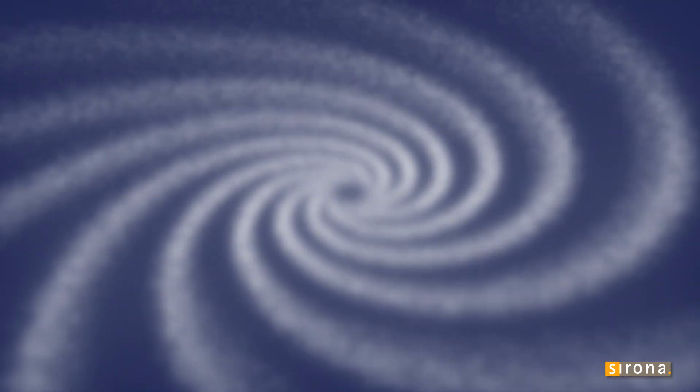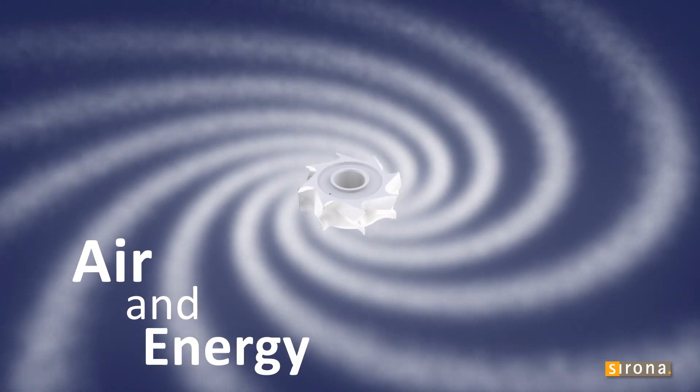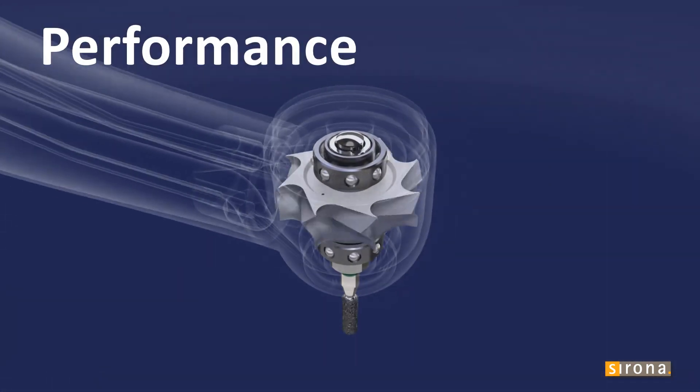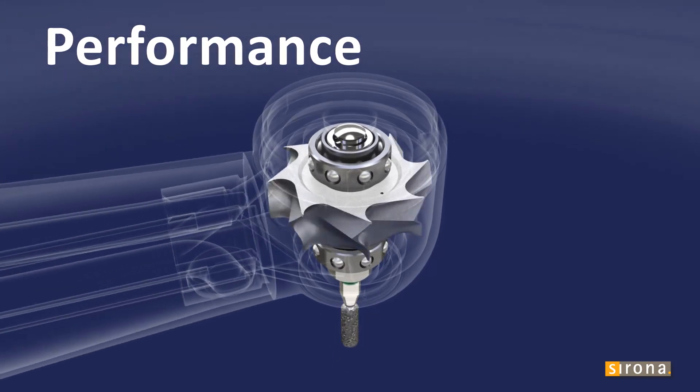A turbine works by air activating the rotor, creating rotational energy which can be put to work. Higher air flow generates more power.